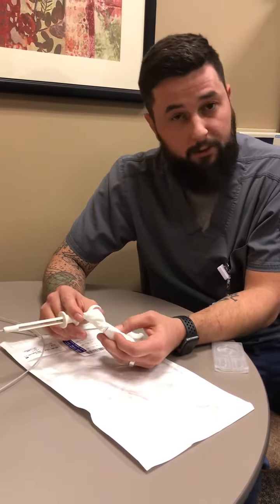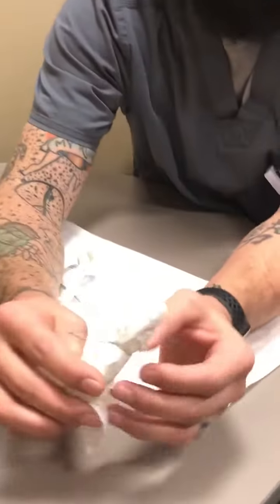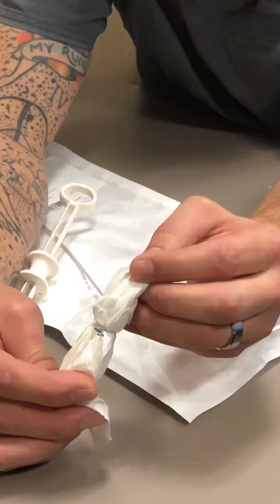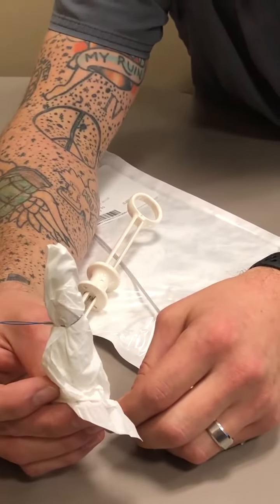Once you get enough resistance and you and the doctor are both confident in your spacing, the doctor will tell you to deploy. Once you deploy, you want to go all the way down. If you do not go all the way down, this little hook will not deploy your poly loop. You have to make sure you go all the way down with your handle, and that will deploy your little plastic piece onto your poly loop nice and tight. Then you are ready for snaring.